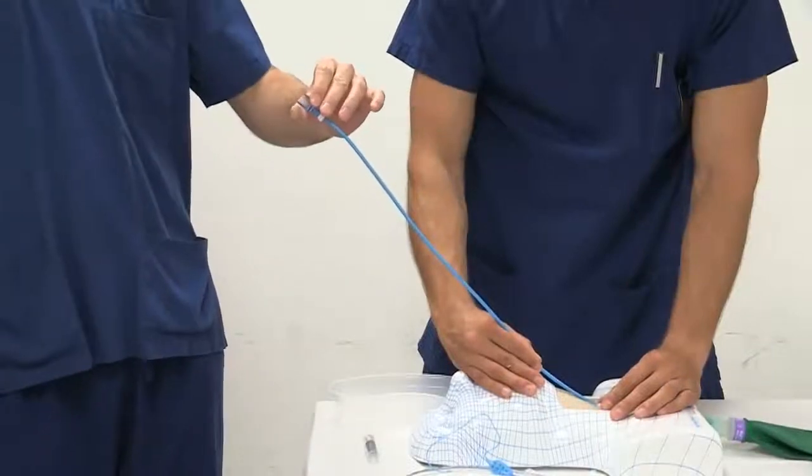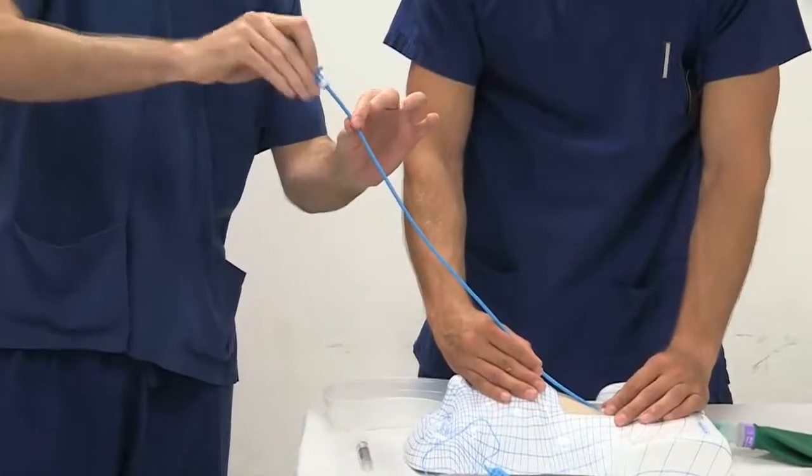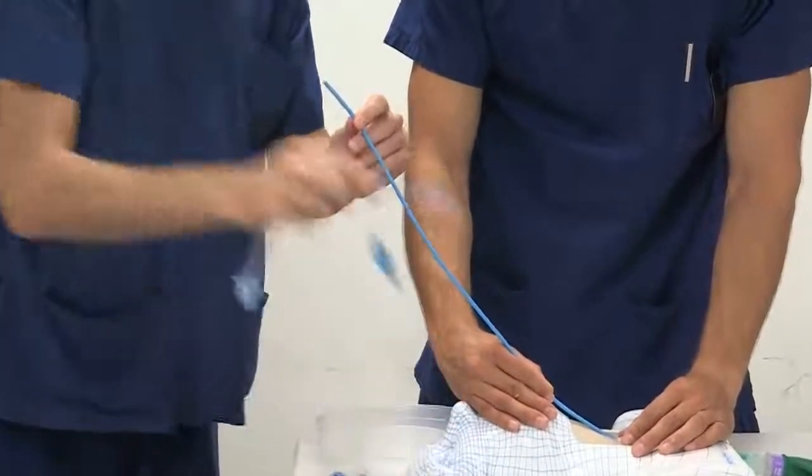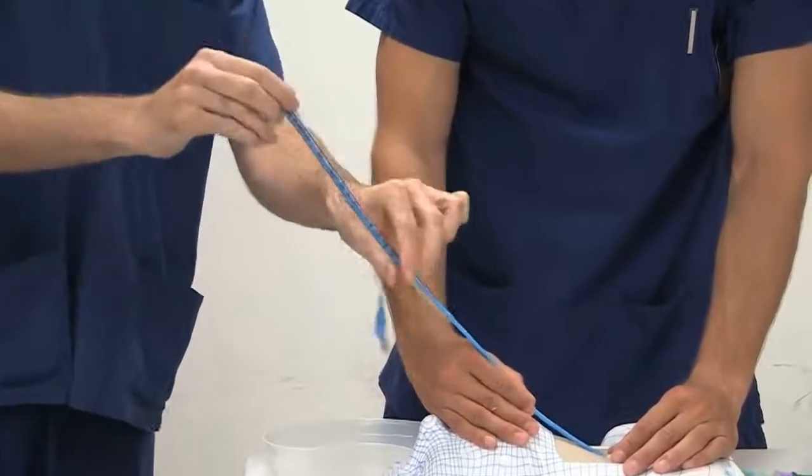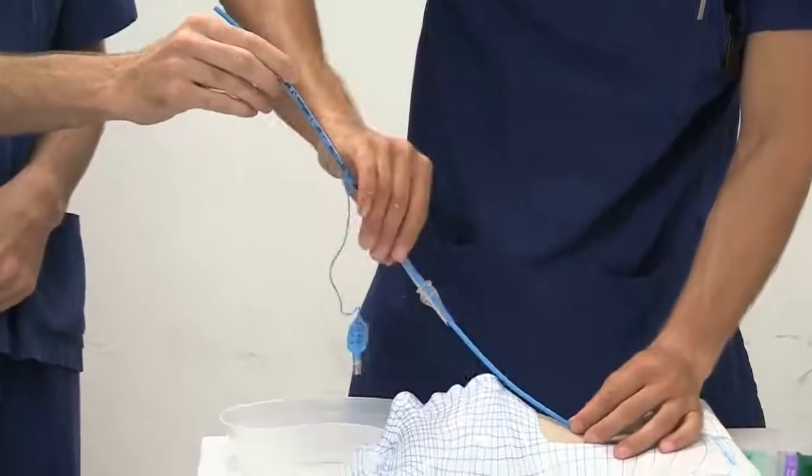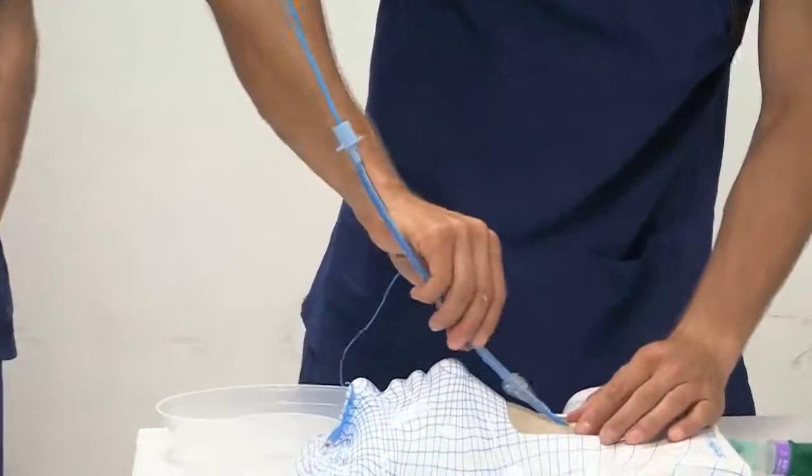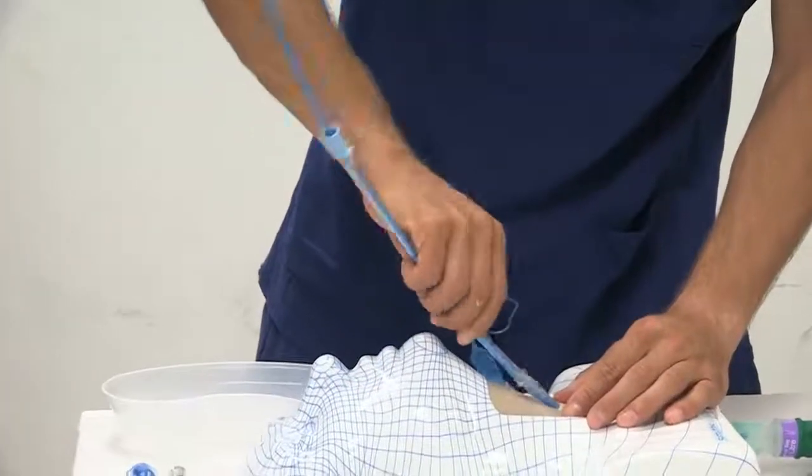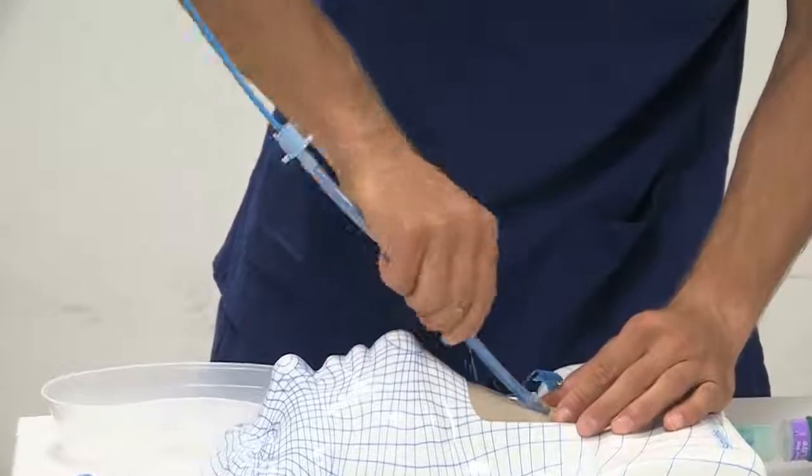A size 6 endotracheal tube is then advanced over the bougie. While the non-dominant hand stabilizes the trachea, the dominant hand guides the tube using a continual 360 degree rotation technique to allow for smooth insertion of the tube into the airway.